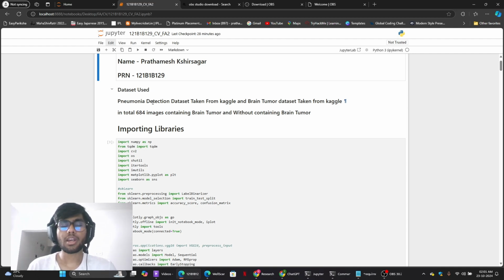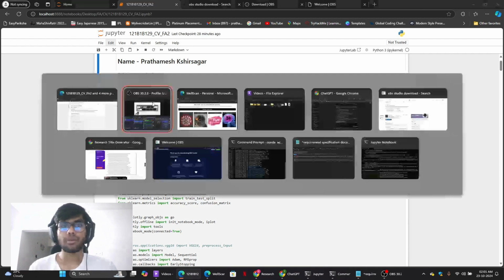I used those models to make a website, the website which will make a change in the future, the website which is helpful for people like us, if people want to detect their brain tumor as early as possible, so they do not have to wait in line as they are waiting as of now. So I've come up with a website.